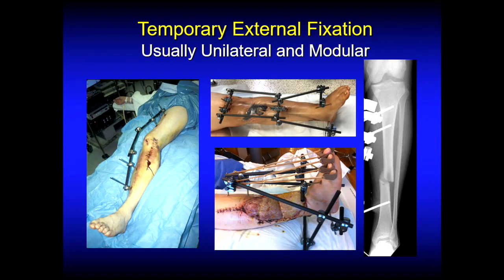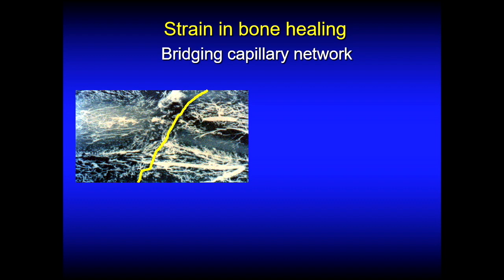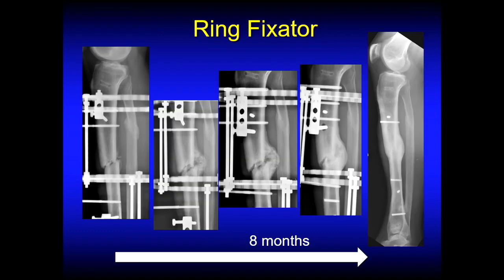The spectrum of external fixation, the lower extremity. Definitive external fixation is where you get the stiffness to the point where you can have bone healing, where you're controlling strain to the point where you can now have either relative or absolute stability. You decide as a surgeon how you're going to construct the frame to achieve the biomechanics that you want at the fracture site. And you're now at the far end of the right in the lower corner of a stiff frame with very little motion. If you're going to have definitive fixation, you're going to have to control strain to allow that capillary network to cross the fracture gap and achieve union. It's the same thing that Stefan Perren taught us, and it's actually the same thing that Ilizarov taught us with ring fixation as well.